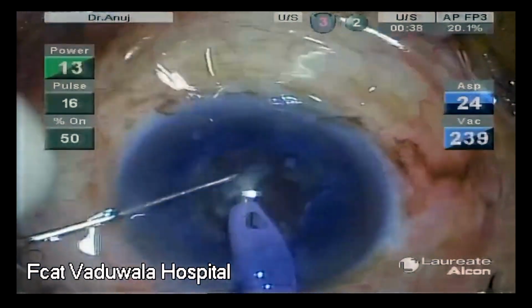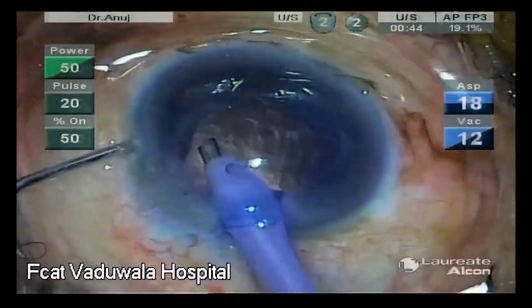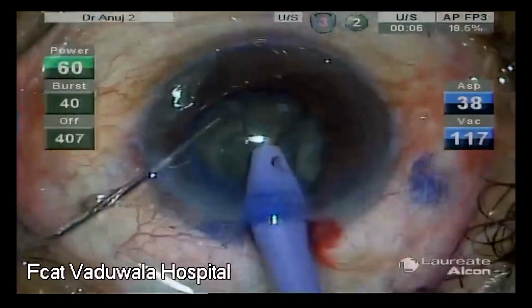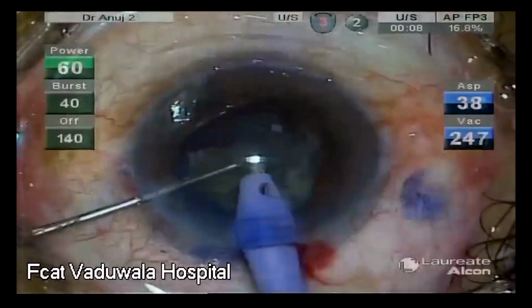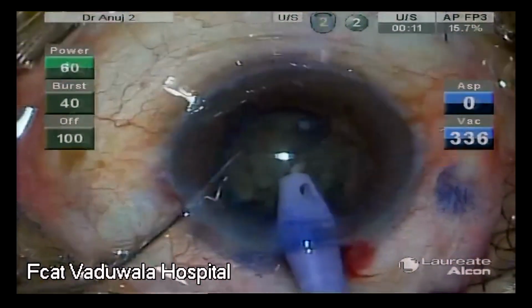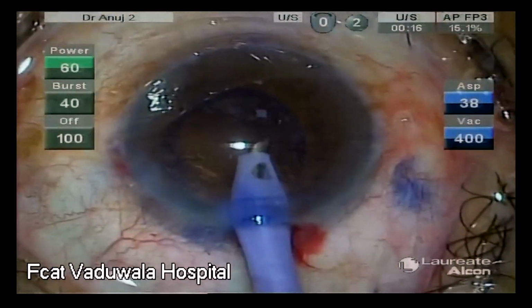If at all the tip needs to go towards the rhexis or under it in the peripheral zone, we need to make its bevel up while doing so. To execute all these movements seamlessly, it is essential to maintain centration of the eye in the microscope view with a good red reflex during the entire surgical process. Lastly, we always have to make sure that the anterior chamber is well formed, and injecting viscoelastic substance before bringing out the phaco probe is a good practice.